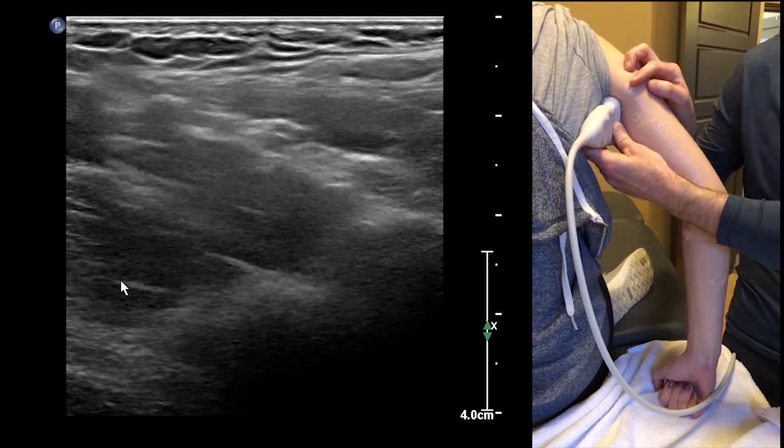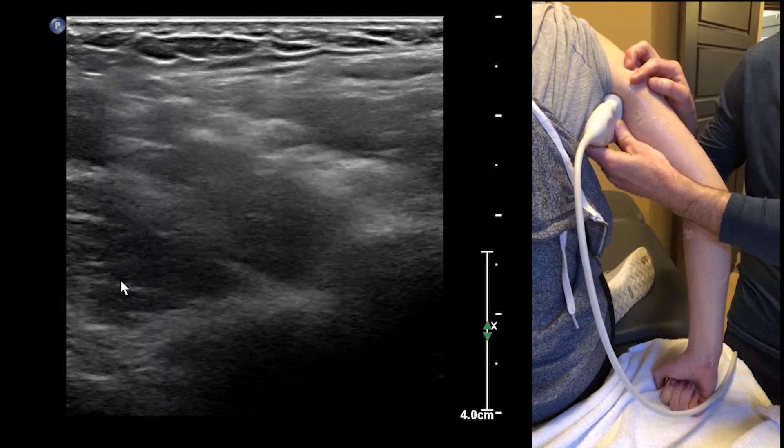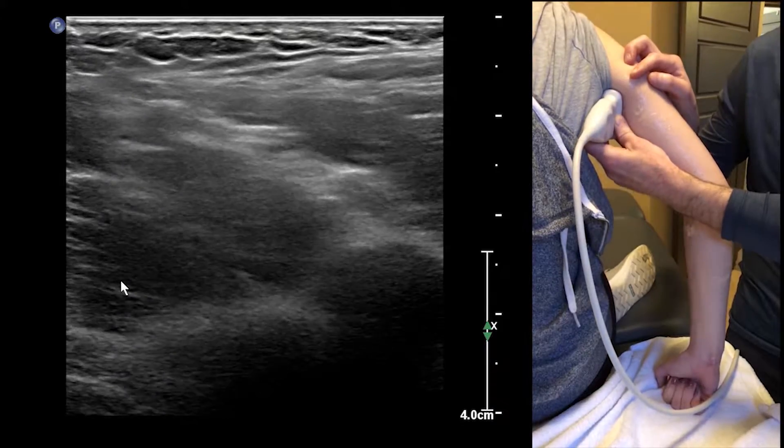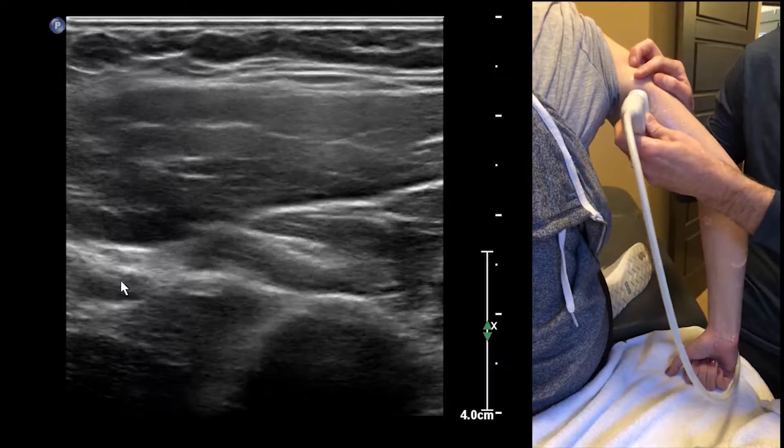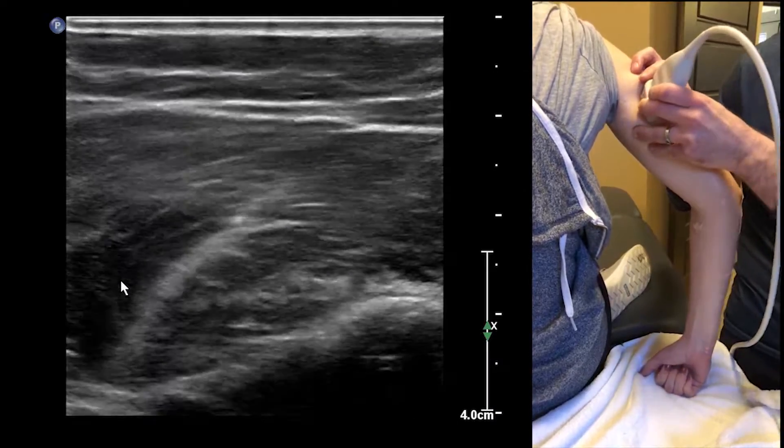There we go. Now we're basically up to the plexus. At this point if you want to get really close, you're going to have to abduct the arm. So we'll just follow it right back down again.